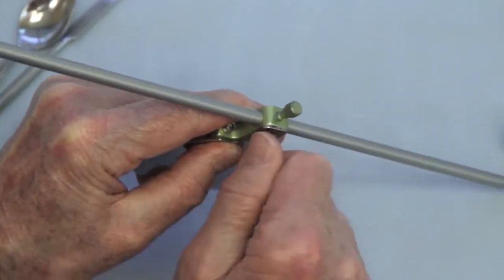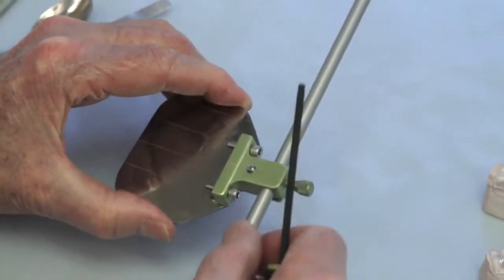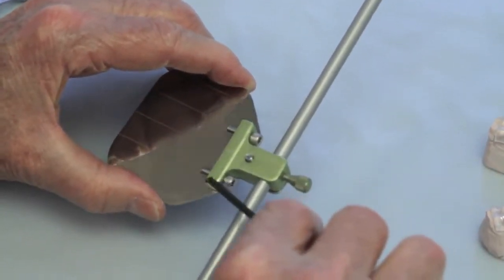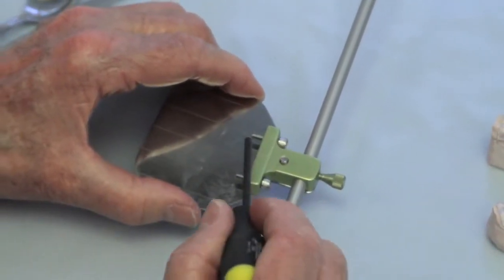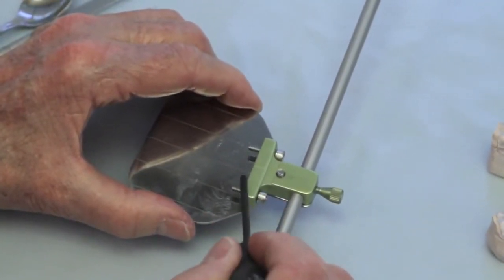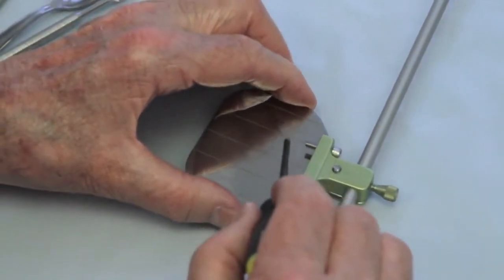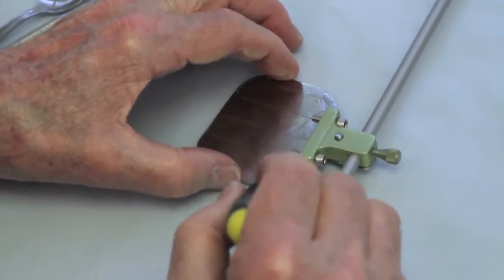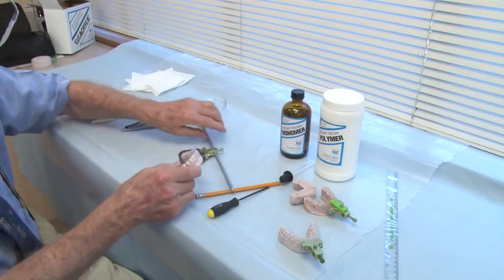Now these two screws should be screwed all the way in, and you do that before you put your crossbar in. You check, make sure these screws are screwed all the way in so you have extension, because your self-curing acrylic is going to attach itself to these two screws, and that's what actually holds in the Biocryl of the lower teeth. And it would work like this.